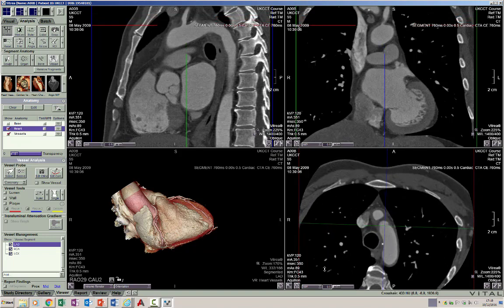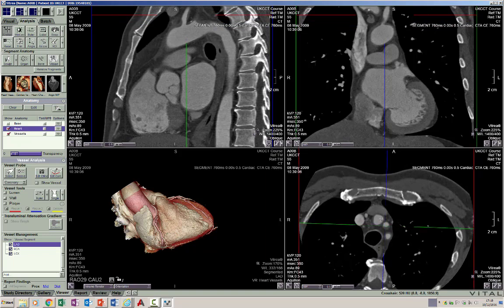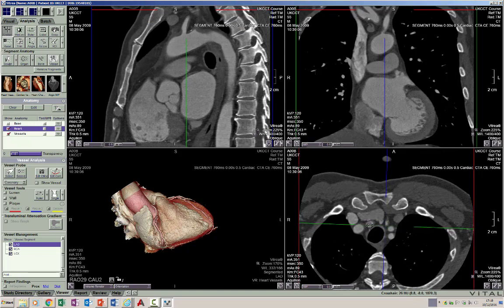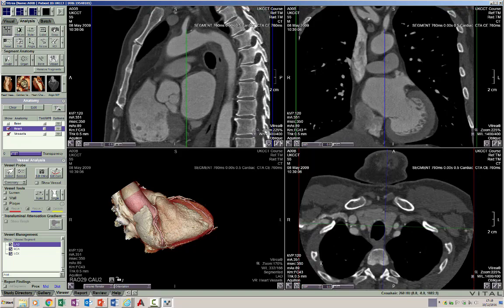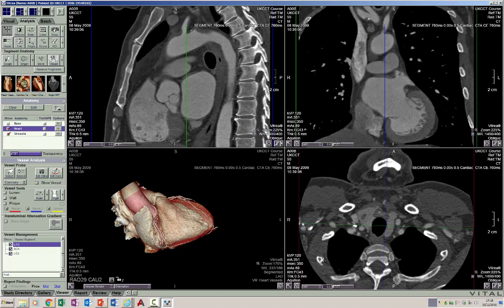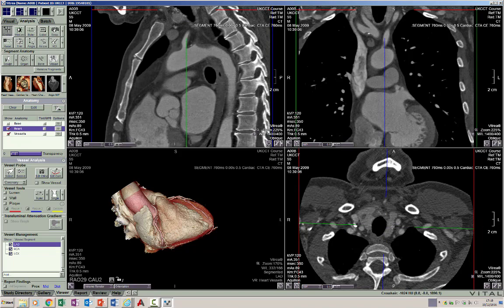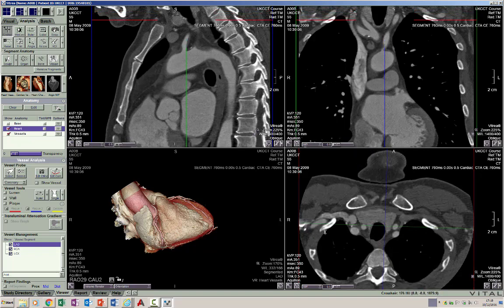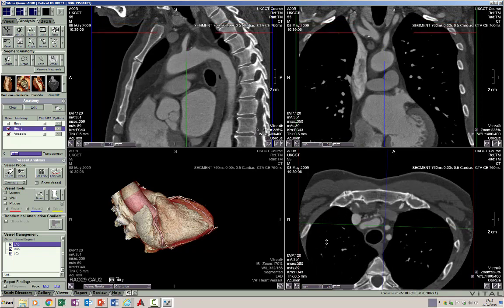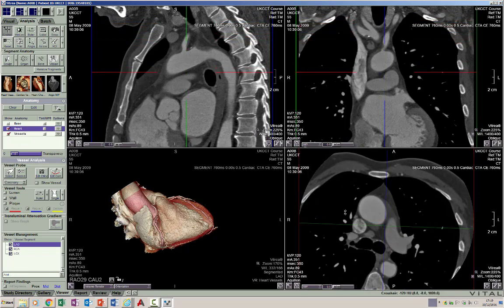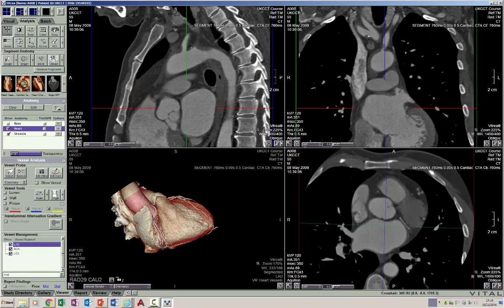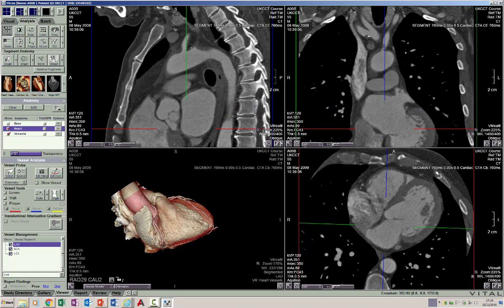The two brachiocephalic veins, left and right, join together to form the SVC. Going up, we can see the brachiocephalic artery dividing into the right subclavian artery and the right common carotid artery going up along the right aspect of the neck. In the midline is the trachea, and on either side the two lobes of the thyroid gland, the left subclavian artery, and the left common carotid artery. This concludes the anatomy of the vascular structures in the mediastinum, cardiac chambers, and LV segmentation. We will now proceed to the anatomy of the coronary arteries in the next section.